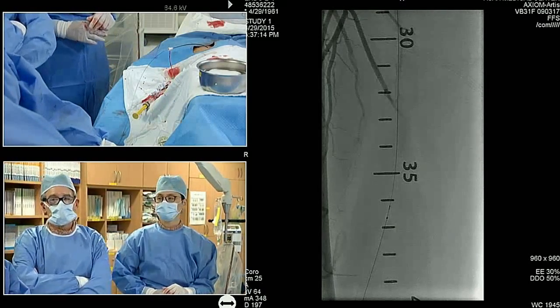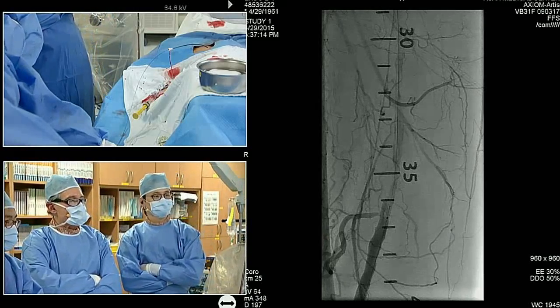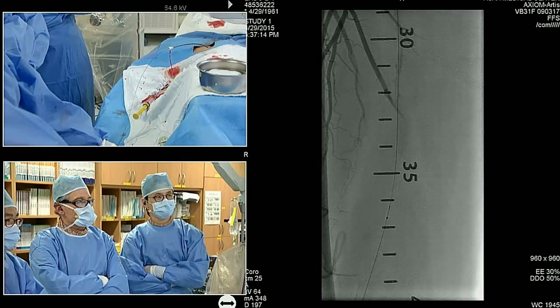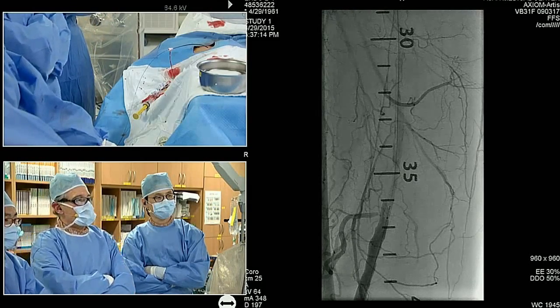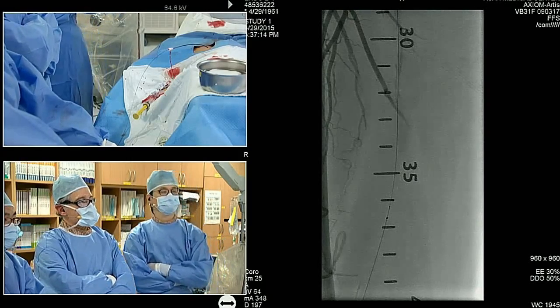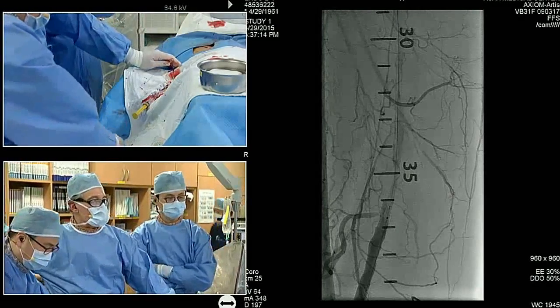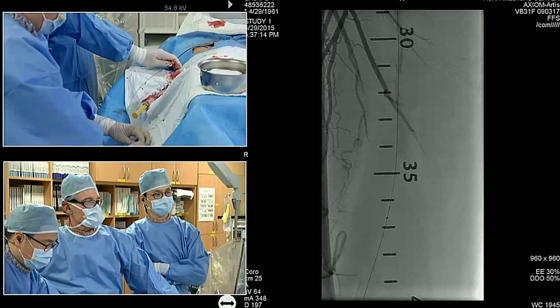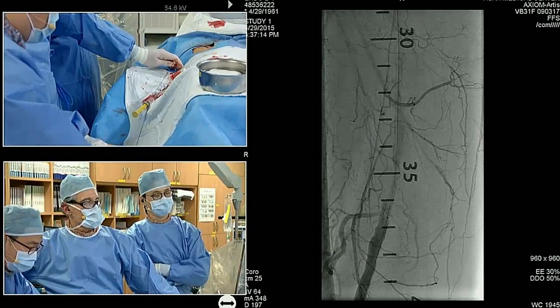Everyone agree? So what do you think, Dr.? Do you put the stent in this case? Yeah, but it looks disrupted already. You have two options: a larger balloon and the coated balloon. Another thing is the stenting technique after the larger balloon. I prefer spot stenting instead of the full long stent.